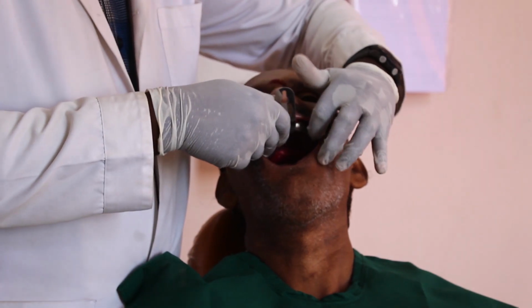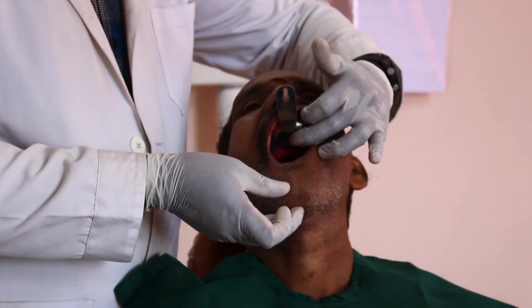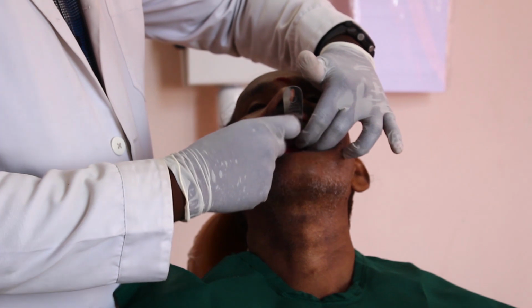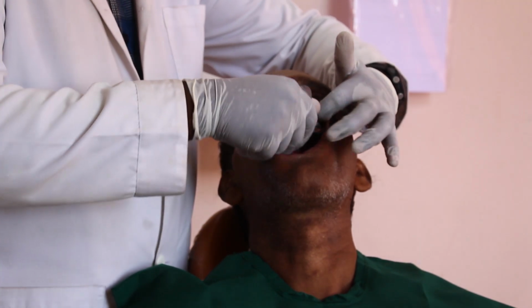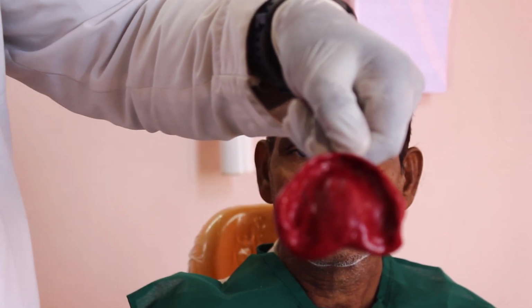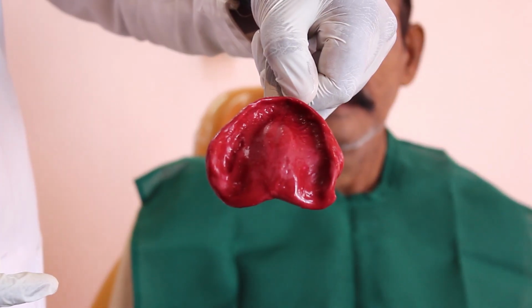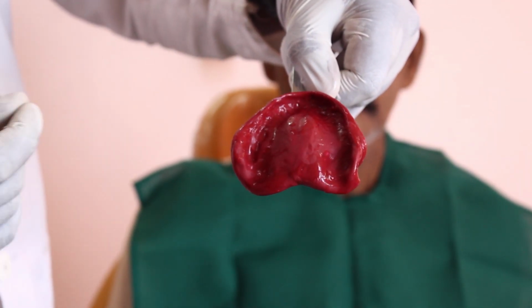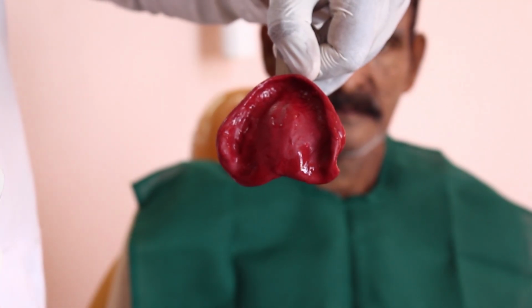Just release the peripheral borders. Slightly ask the patient to close the mouth, because it will make the soft tissue flaccid. And then you have to remove it in a single stroke. Now you can see the impression has been recorded properly. If any area is deficient, you can add to it in an incremental way, and then you can remold it.